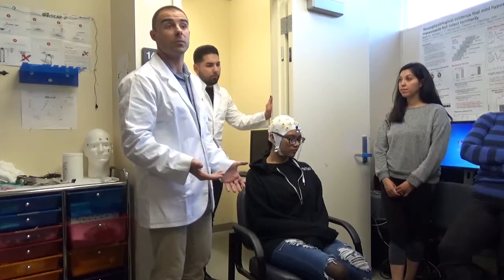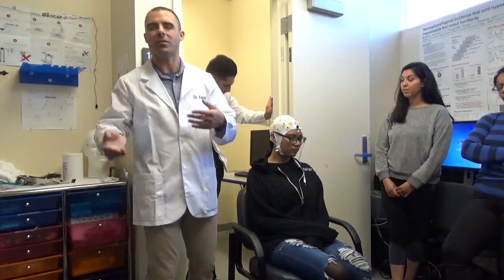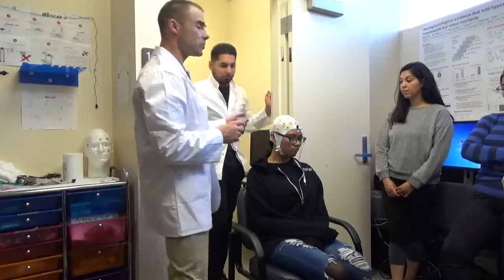We tend to screw it up, because we bump into her, or we bump into the wires and pull them out, and they either pull off of here or pull out of there. They're very delicate, very sensitive. You know, this is on us. We just want to be conscientious and all that kind of good jazz. So, with that said, we now start filling up these capsules with some gel.